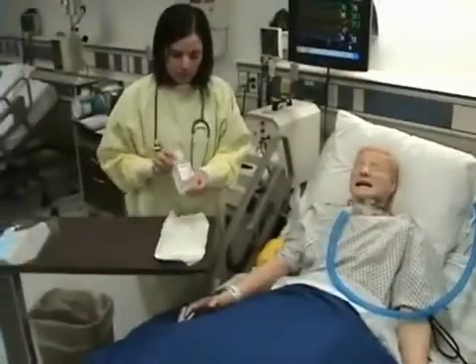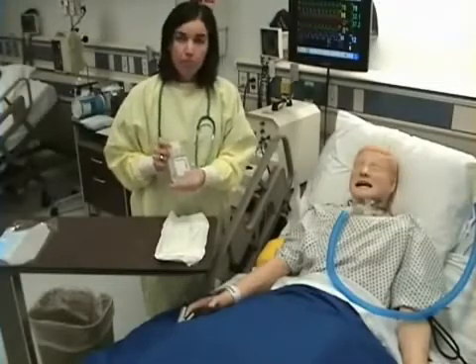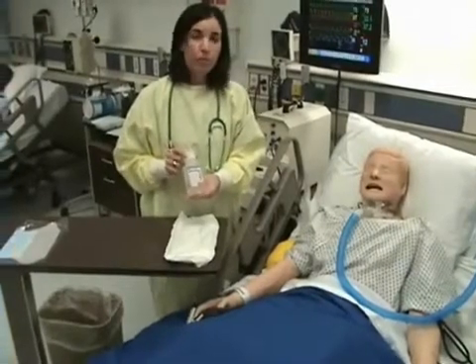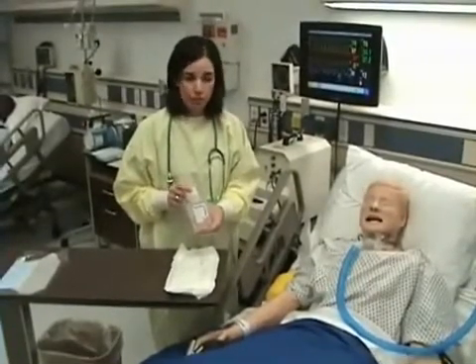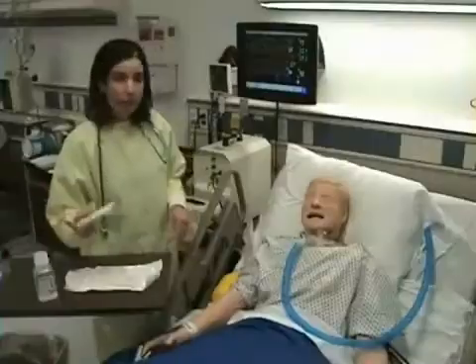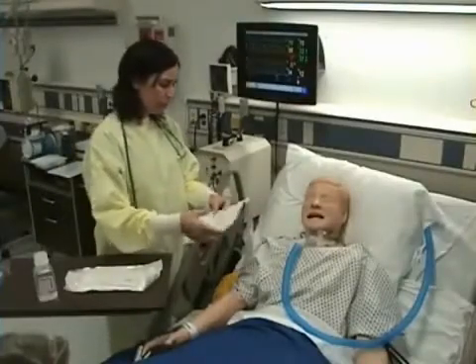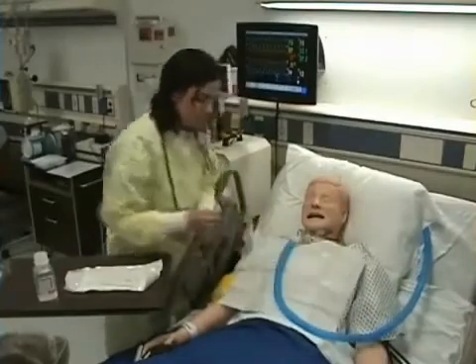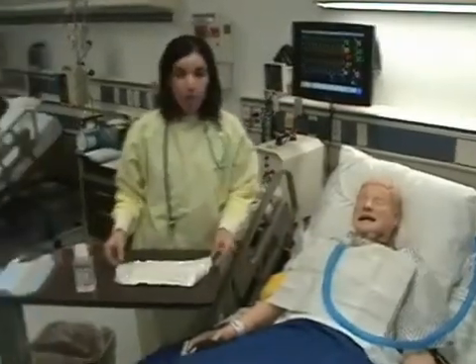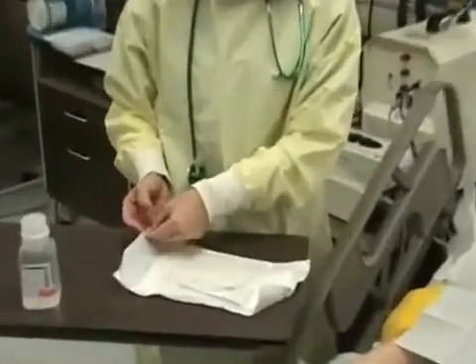I have my normal saline. I want to check the expiration date. This is a brand new bottle, so once I open my normal saline, I am going to date, time, and initial it. It is good for 24 hours. I have a drape that I'm going to drape across my patient just to protect their gown. Now I will open my kit and set up my supplies.